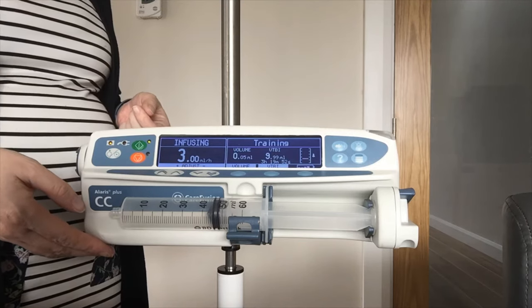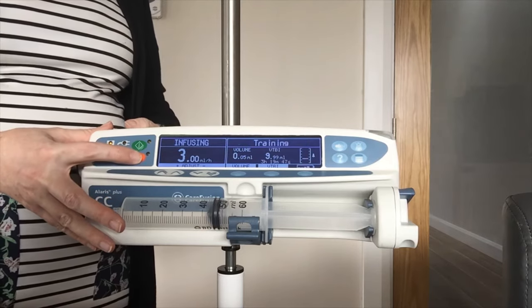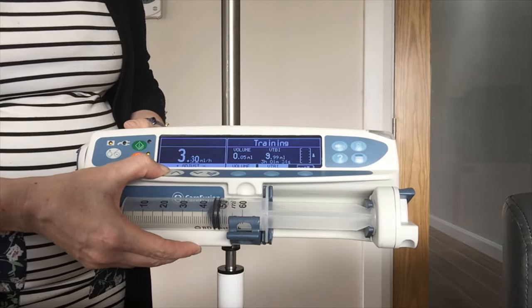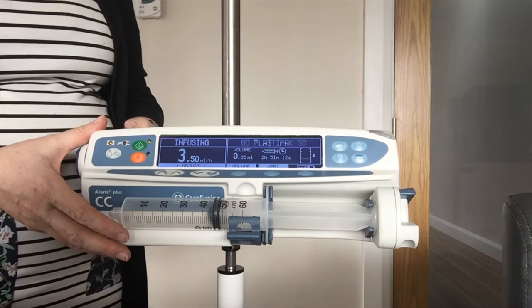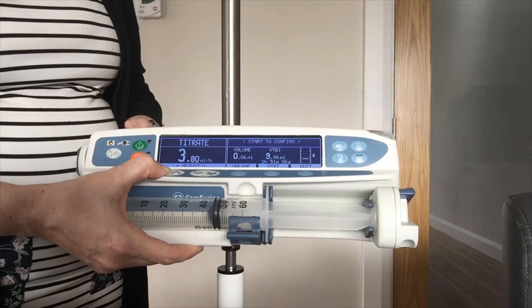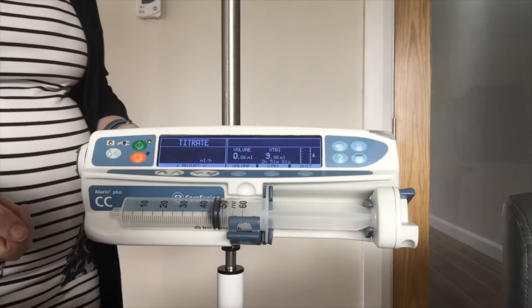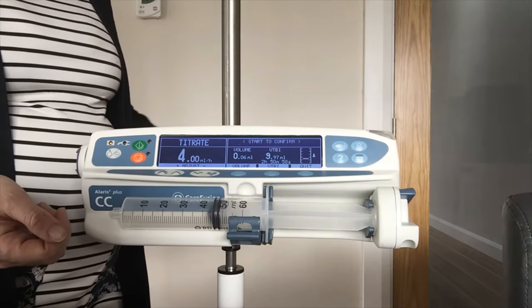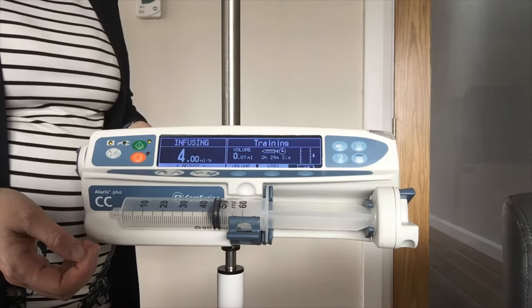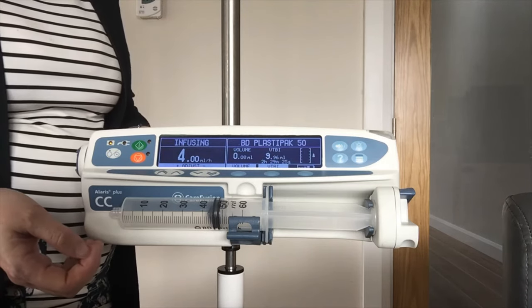If you need to change the rate of your pump you have two options. You can either put your pump on hold using your orange key, titrate your rate, and press green again to restart — or you can titrate without putting the pump on hold, just using your arrows up and down to adjust the rate and pressing green to confirm. If you titrate without putting the pump on hold and forget to confirm your new rate, the pump will call you back. The advantage is you are not stopping medication to your patient — you titrate and confirm your new rate, and if you don't confirm it keeps infusing at the old rate.